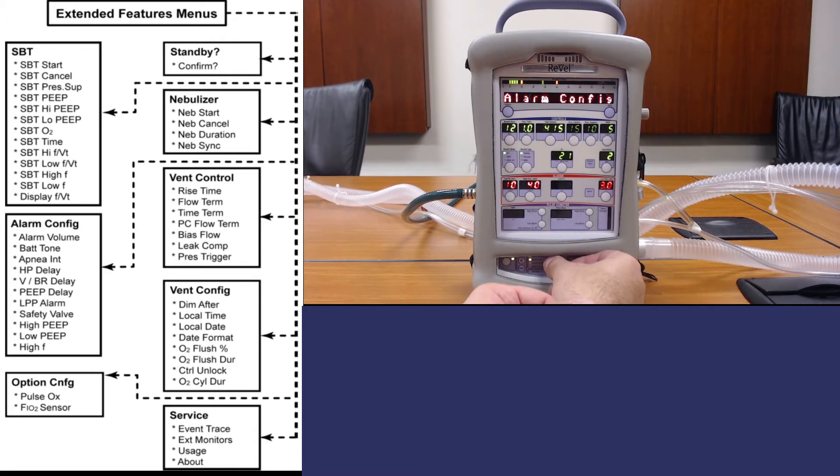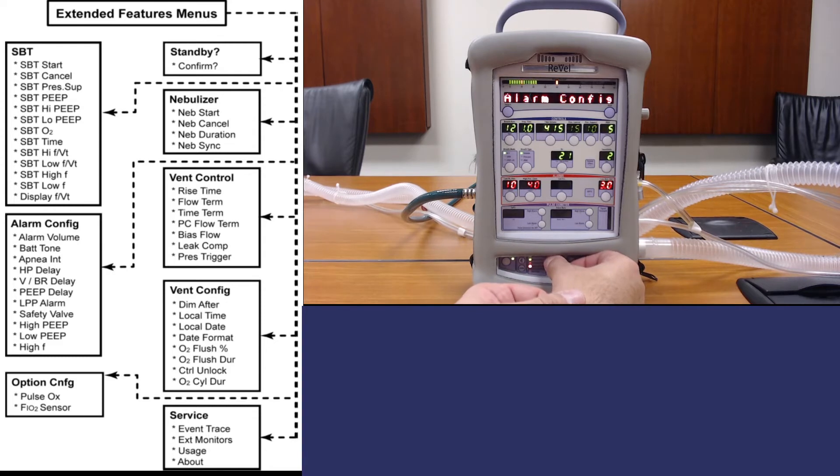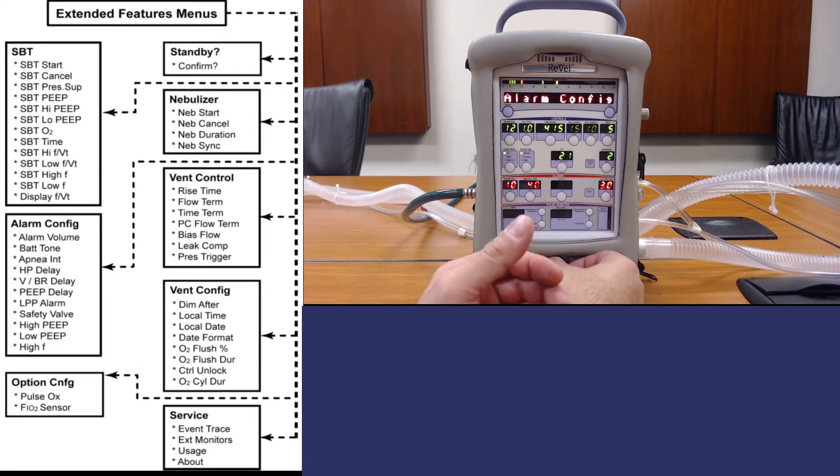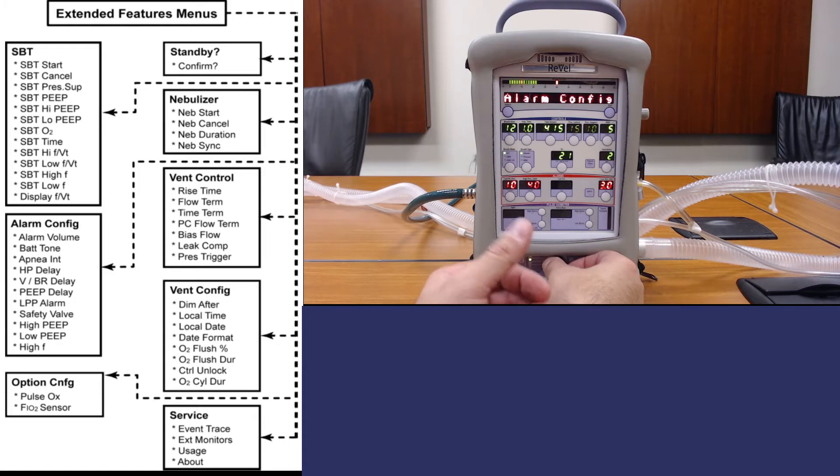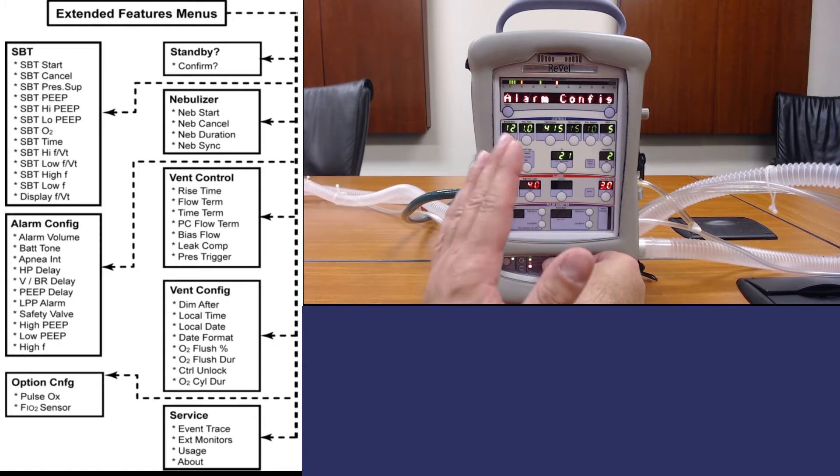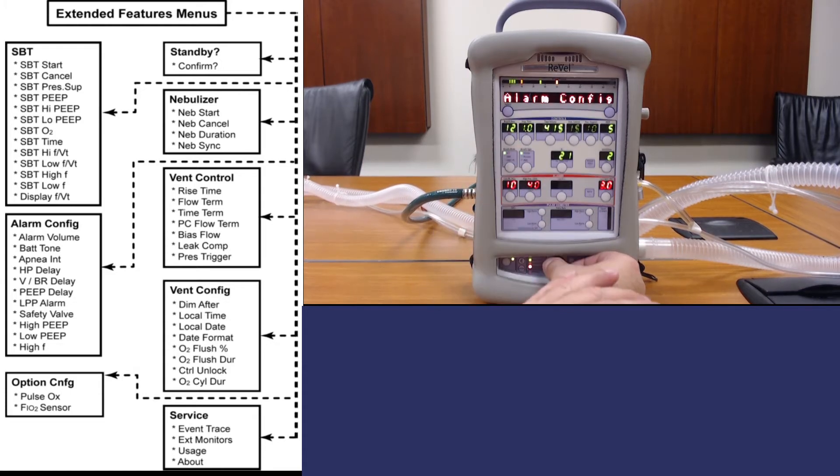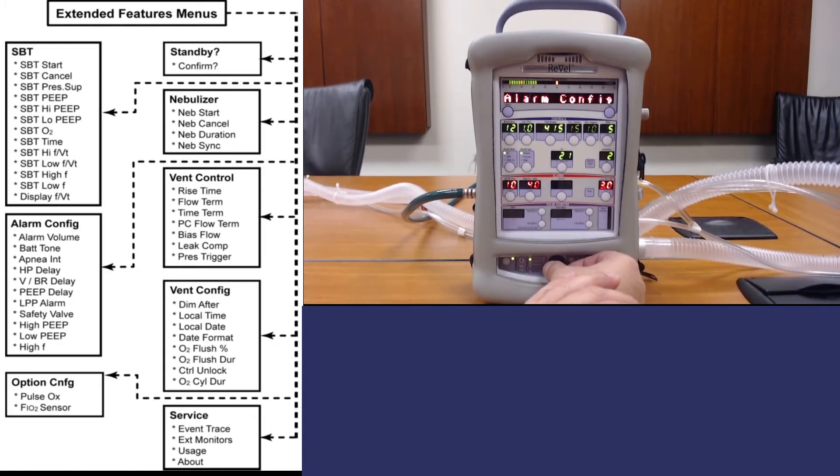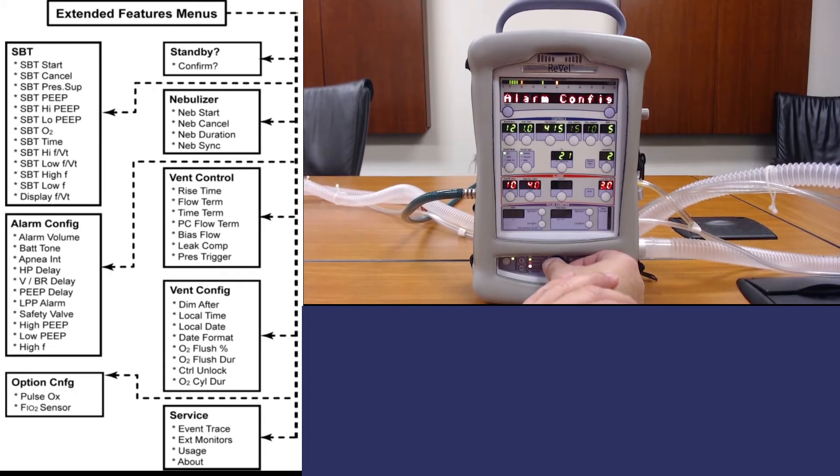In alarm config you can change the different parameters of the alarms, the volume, the tones, the delays, but we aren't going to touch those. Those are preset based on the department's mandate.